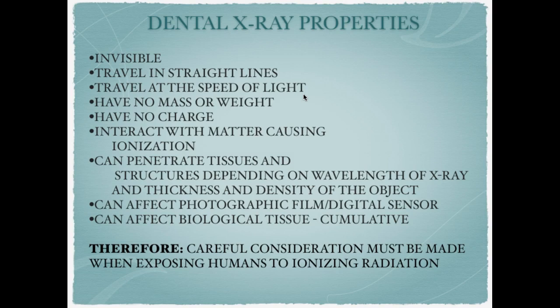Okay, so there's really no need to be frightened of using X-rays if you're following proper protocol, and we'll look at that in another presentation. They have no mass or weight. Your patient doesn't feel it. They have no charge. They interact with matter causing ionization. That's why we need to be very careful and use them selectively.